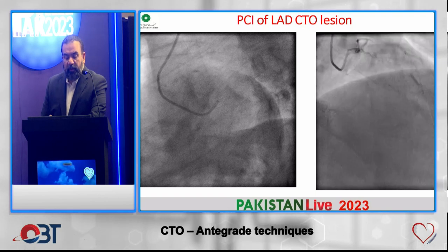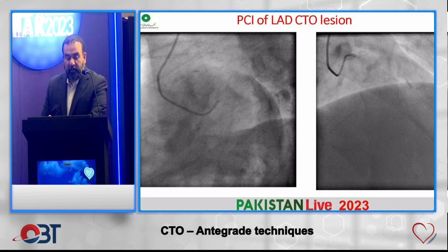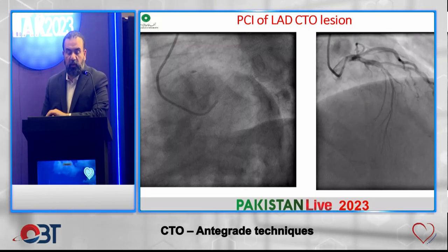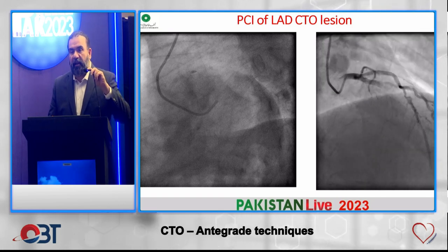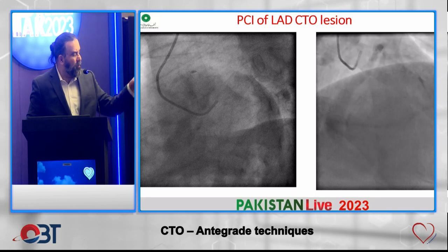This also highlights the challenge that in different views, maybe Dr. Wal, let me play it again. In different views the stump appears differently. So in one view, identifying the stump is very difficult to do. Can you play the first video?